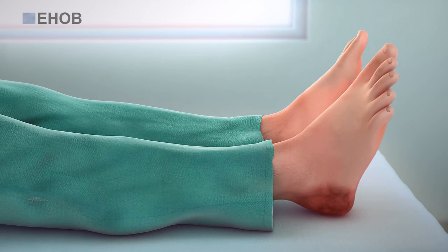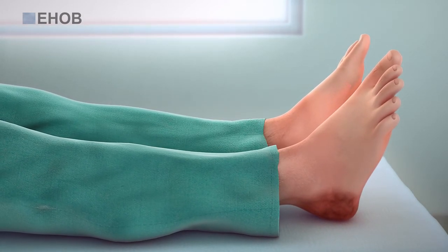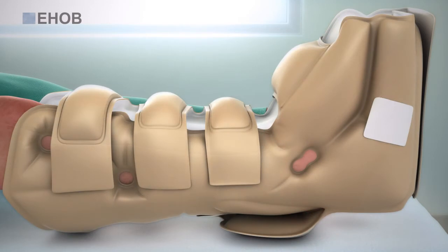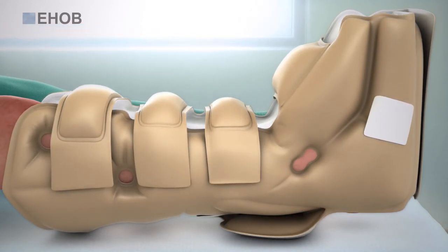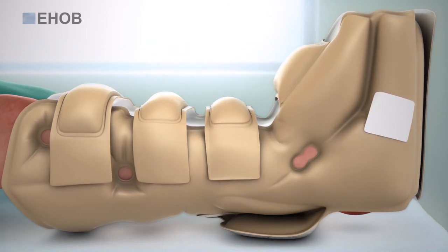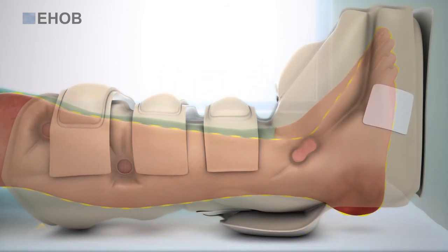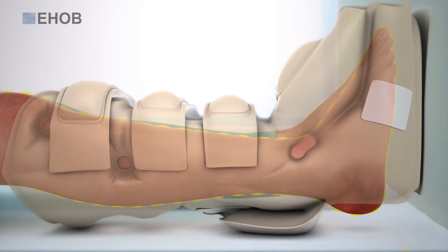In Hooke's law, the deformation of an elastic object, in this case the skin and underlying tissue, is proportional to the stress it endures. By placing the calf and foot in a foot waffle, the distortion of the soft tissue at risk is minimized around the bony prominences. The heel complex and Achilles tendon are offloaded from the surface of the bed, and the skeletal structures are protected against foot drop and lateral rotation.